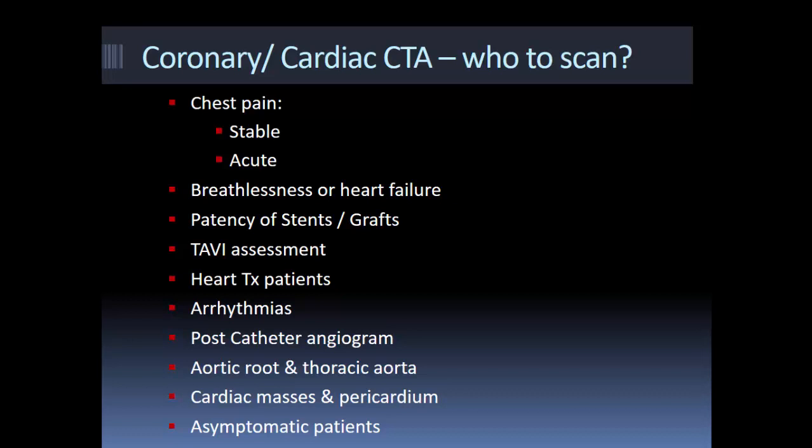Now, one thing to point out is a lot of people use the word coronary CT angiography, and I think it's not appropriate for the technique, because the CT that we do is not just a coronary CT, although that's the main reason why we do it. It's a cardiac CT, so you're looking not just at the coronary arteries, but you're looking at the cardiac chambers, the myocardium, the valves, etc. So there are a lot of things that we are trying to assess on a cardiac CT angiography.